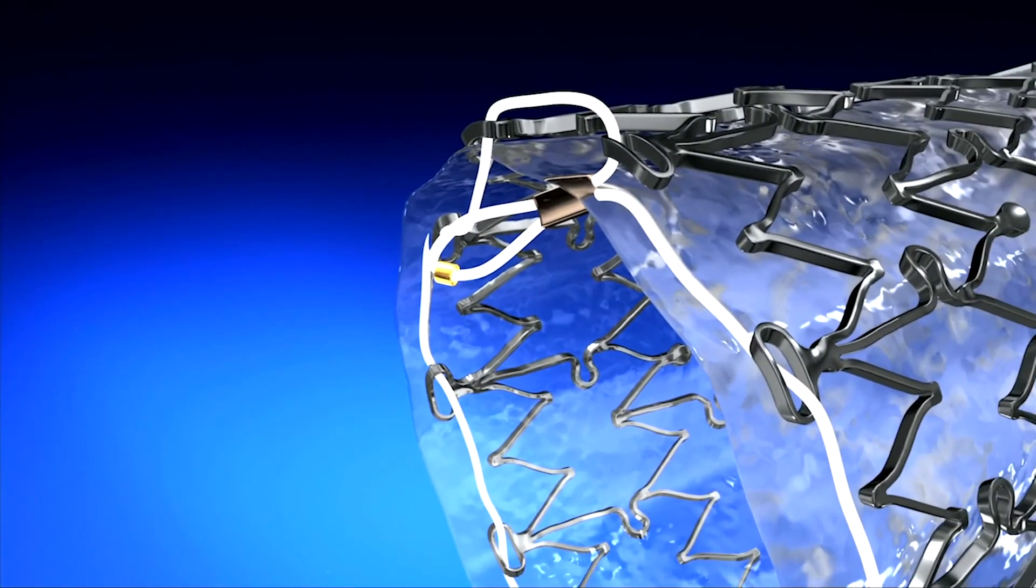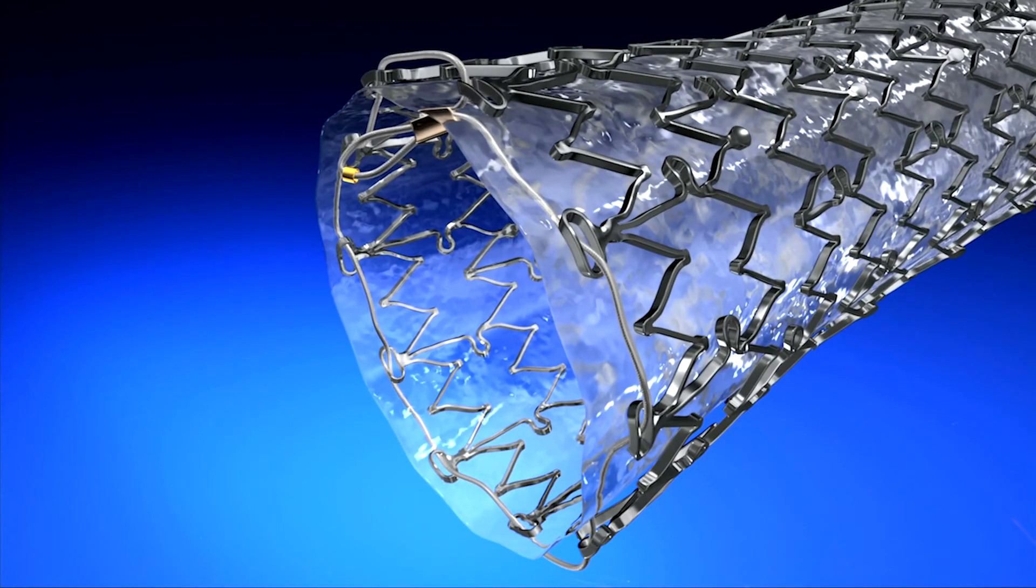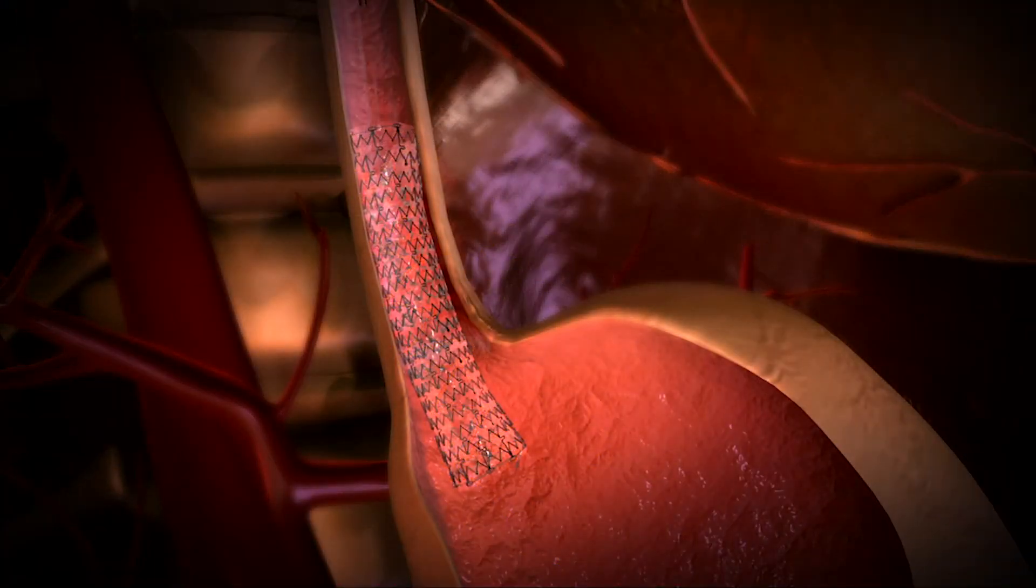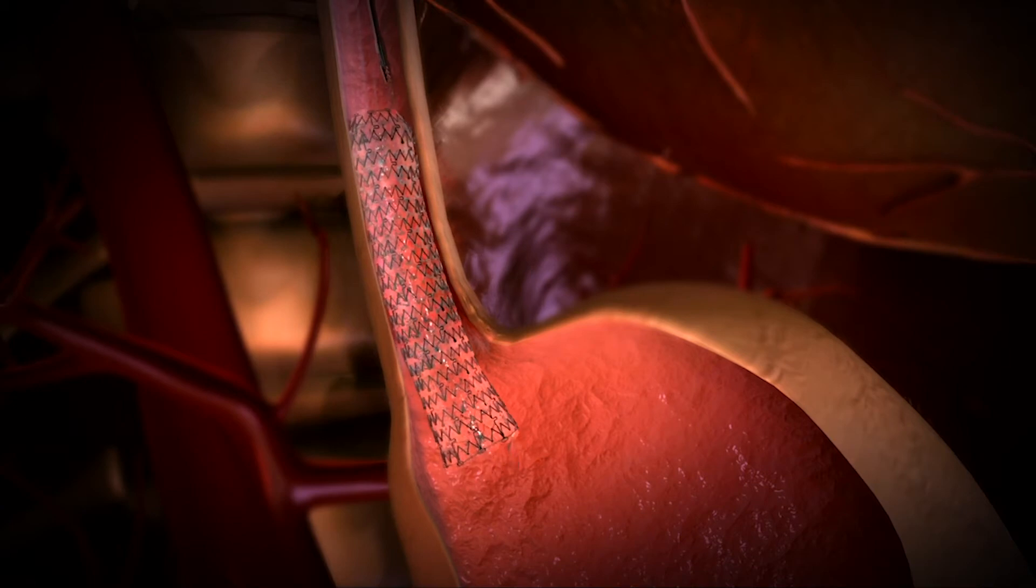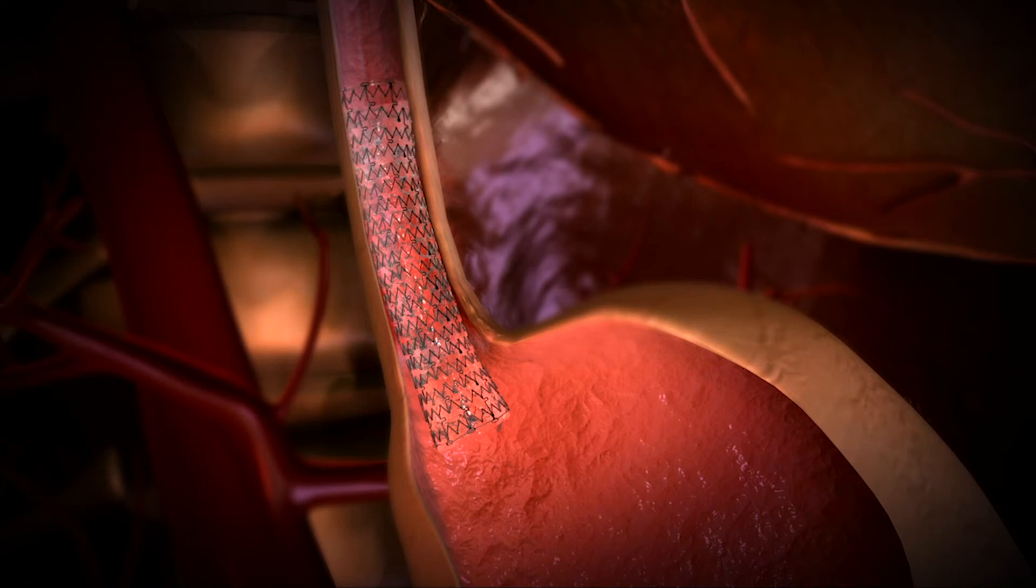The braided nitinol suture and corresponding suture eyelets ease purse stringing and separation of the stent from the mucosal wall. The strength of the metal suture allows the use of most endoscopic forceps while reducing the occurrence of bothersome suture breaks.